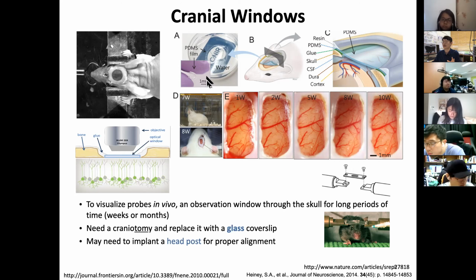And this is a good example of a clear craniotomy. You see how to do this experiment. From 1 week up to 10 weeks, you demonstrate that the quality of the window is still clean. This is quite rare though. When you do a good job, this is possible.